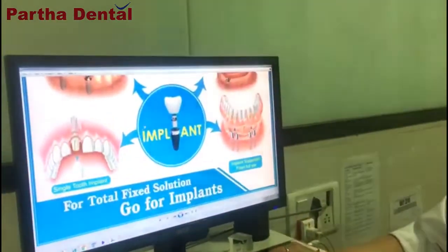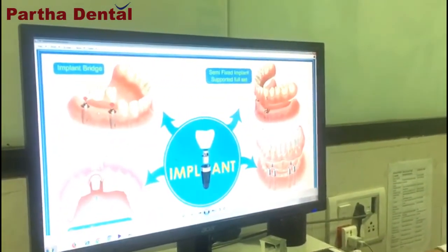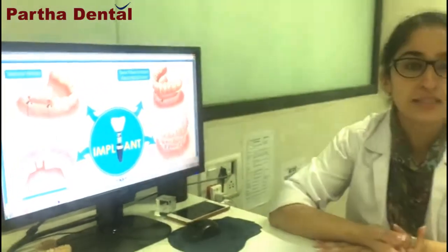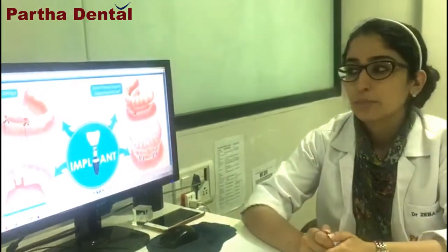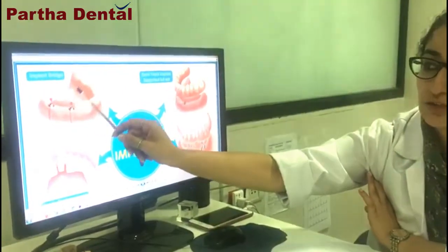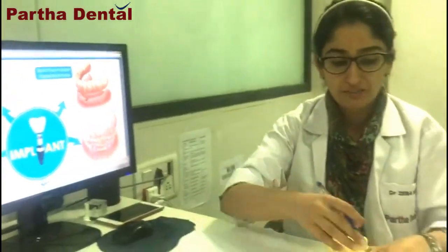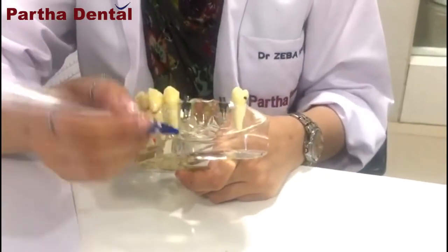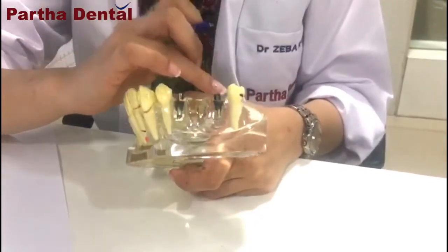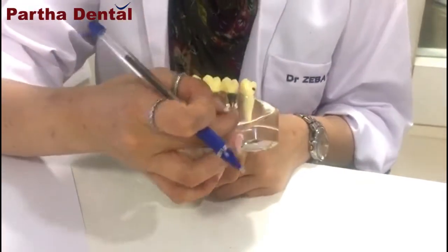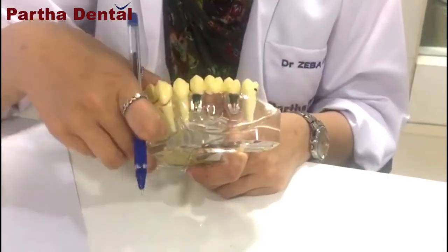The second way in which implants are used is for replacement of multiple missing teeth. You can see here there is a long span of missing teeth — three teeth missing. People would think we will be placing three implants, but no. What we can do is place two implants and then give a bridge over it. As you can see in this model, three teeth are replaced with placement of two implants only.